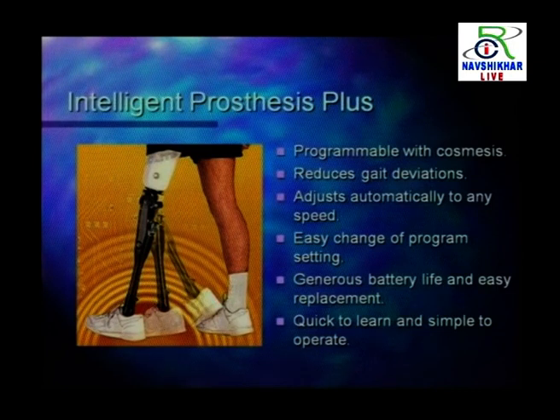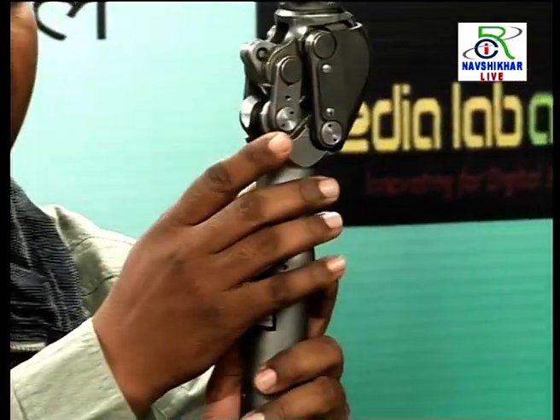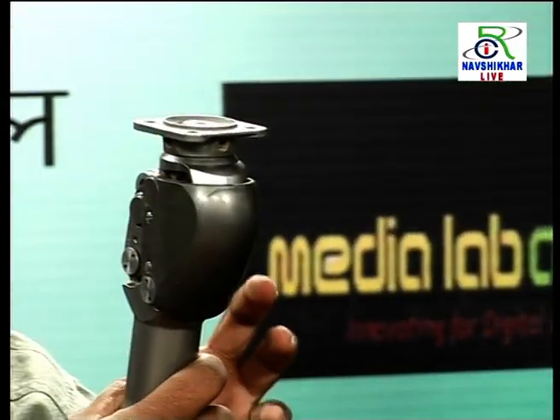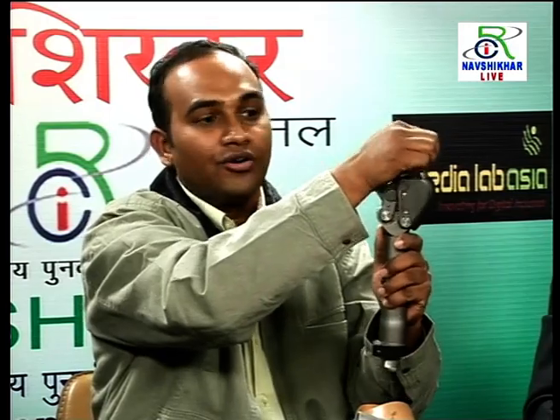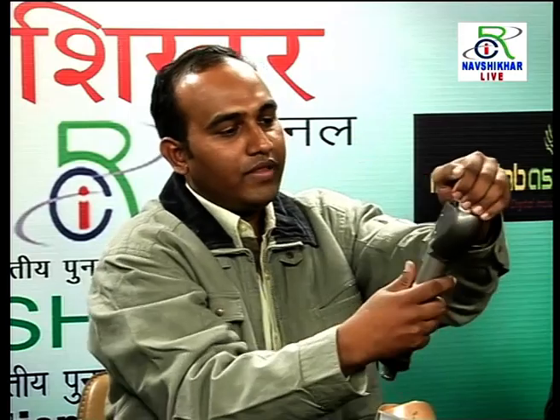Basically, the latest version is an intelligent prosthesis. Intelligent prosthesis is nothing but a circuit, a chip that has been incorporated with the knee joint, which controls the movement of swing phase and stance phase control. It controls the piston movement as per the sensing. It senses the movement of the other limb, the other leg, and according to that sensor, it controls this movement. So if the patient wants to run faster, it will sense the movement and make it easy, so that the movement will be fast. If the patient wants to resist himself, to stand himself, it will automatically resist the movement, lock the knee joint and grip the movement, so it will make him not move his leg.